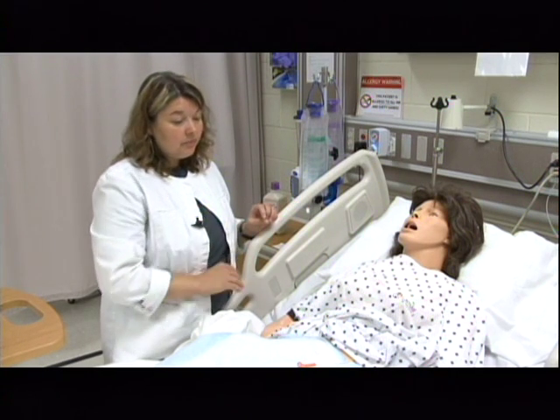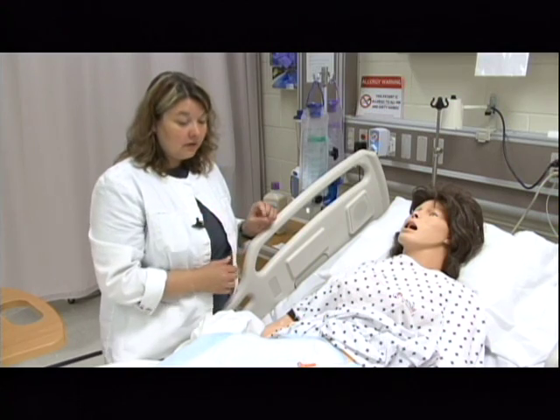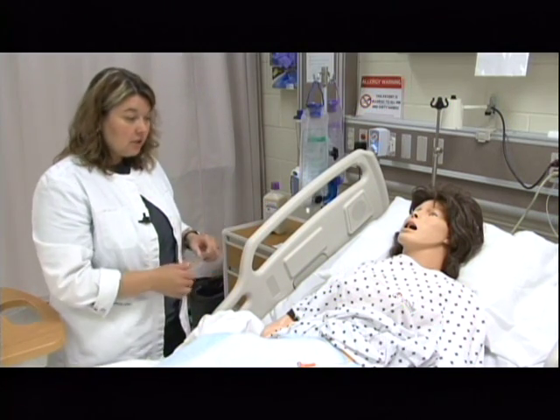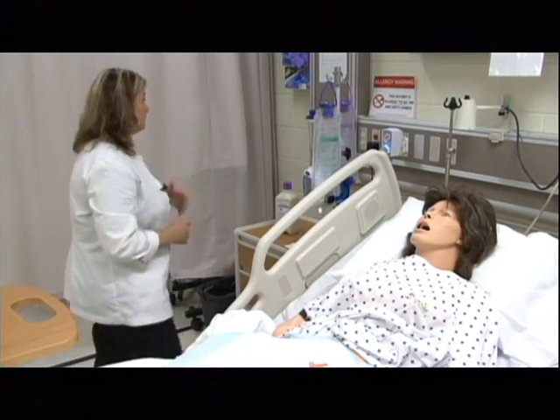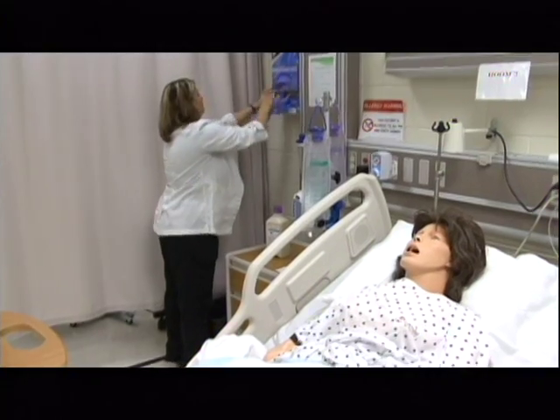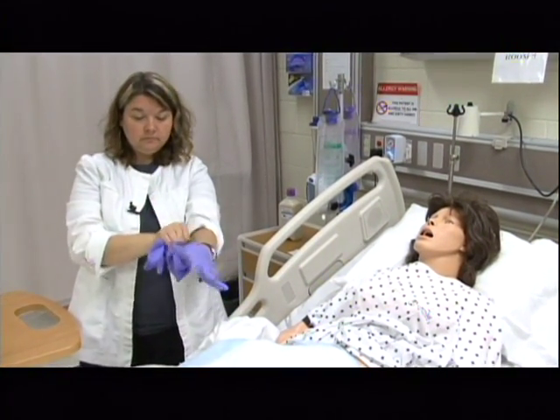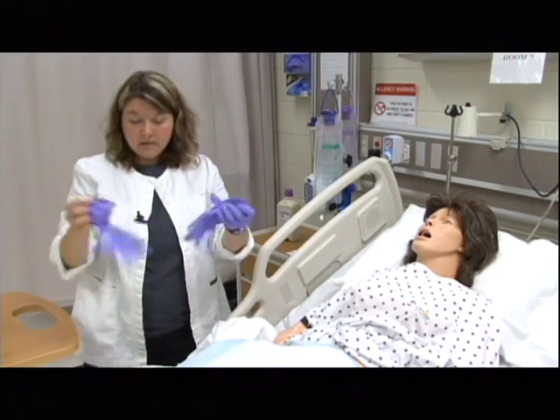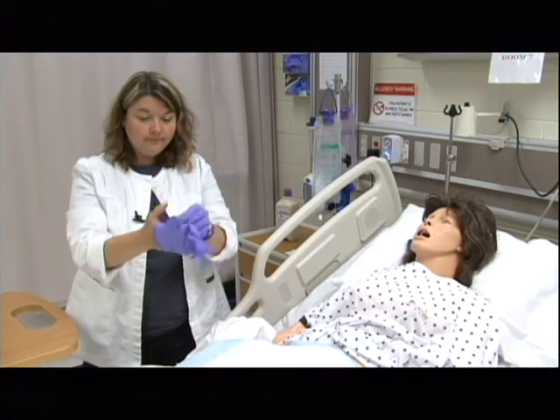One of the reasons for keeping the head of the bed elevated is you prevent the patient from aspirating and having further complications. She says she can tolerate this position. I've got her sitting up between the 30 to 45 degrees. I'm going to go ahead and grab my gloves at this point. And of course, this does not require sterile gloves. This is not a sterile procedure.